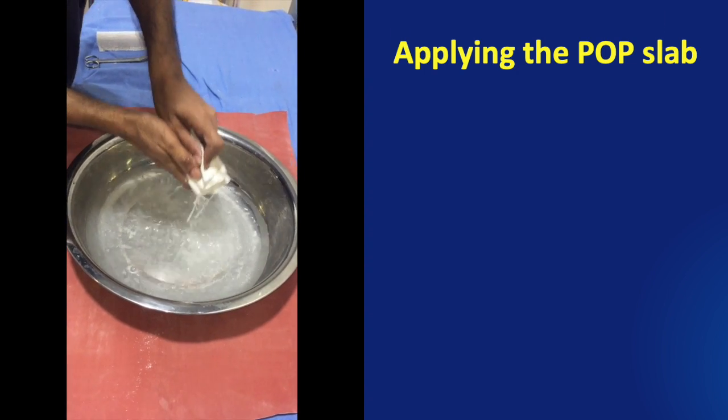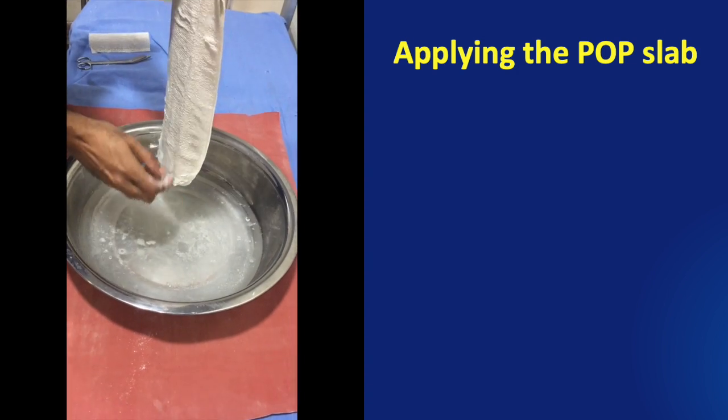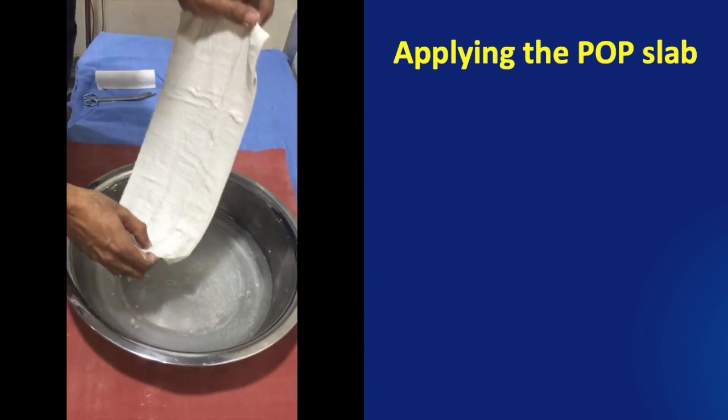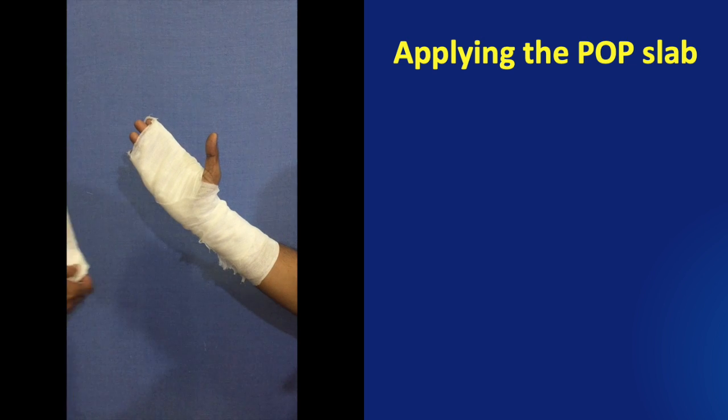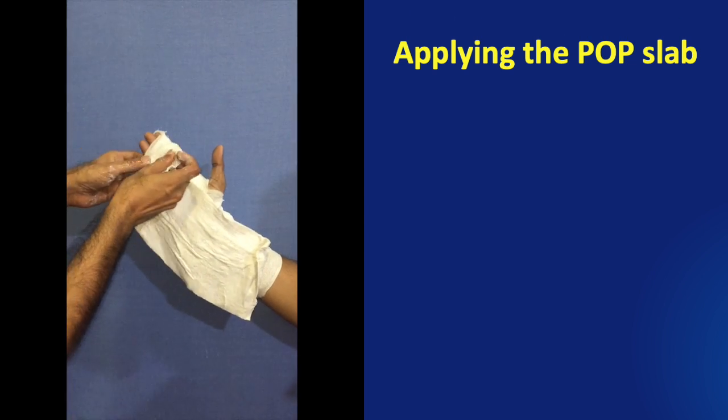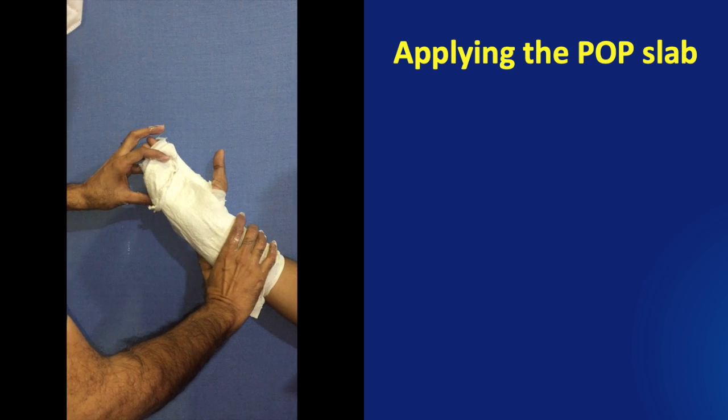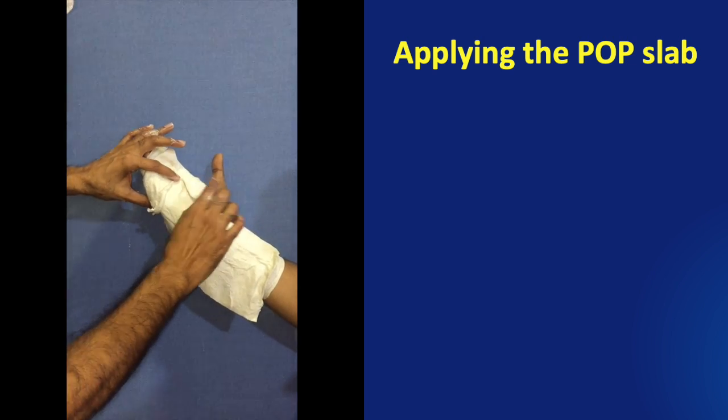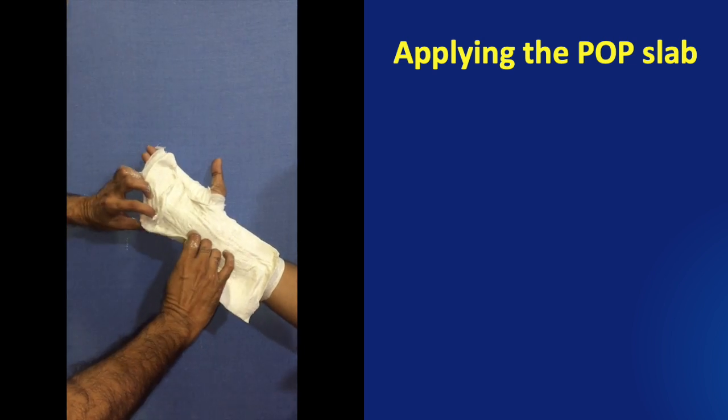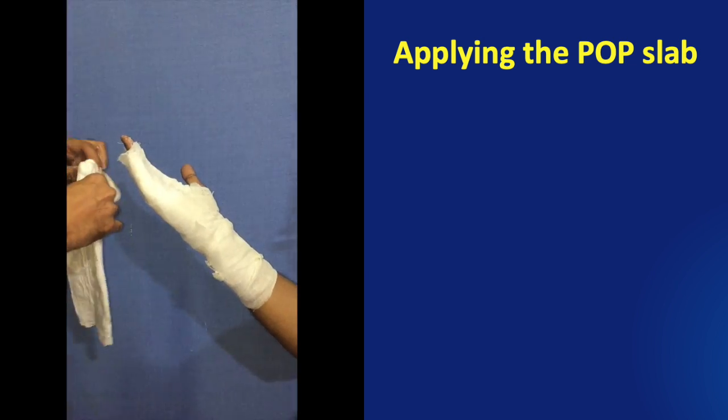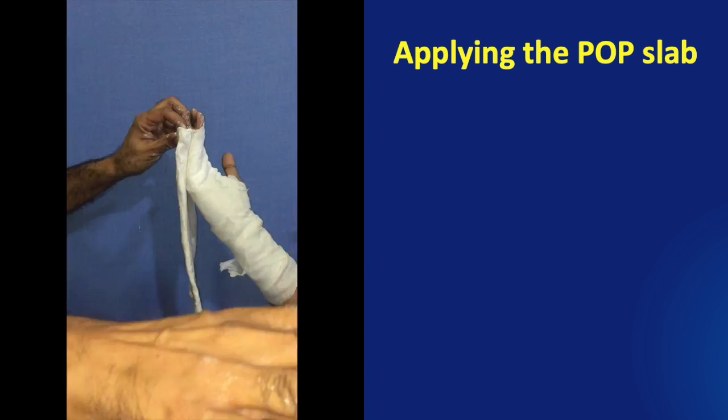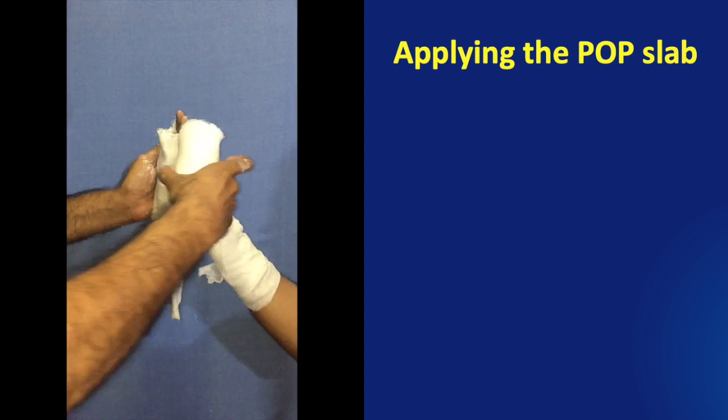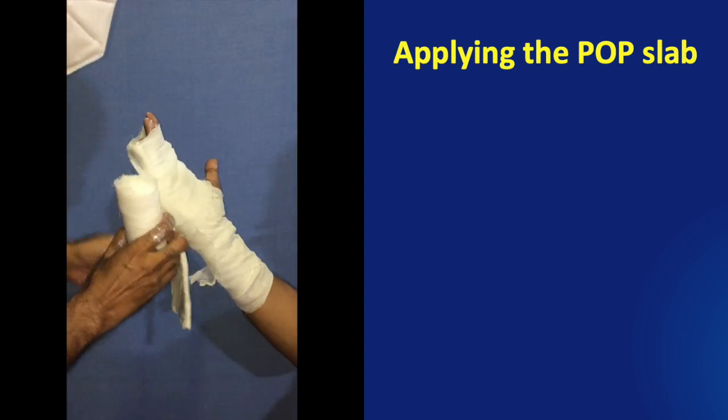Now remove the POP from the water. Gently drain off the excess water and apply over the soft pad or dressings on the hand. If on the volar side we should allow some movements of the thumb. So we need to make the palmar area of the POP slab a little narrower. If the POP is being applied on the dorsal side we make sure that the wrist is kept in neutral position.